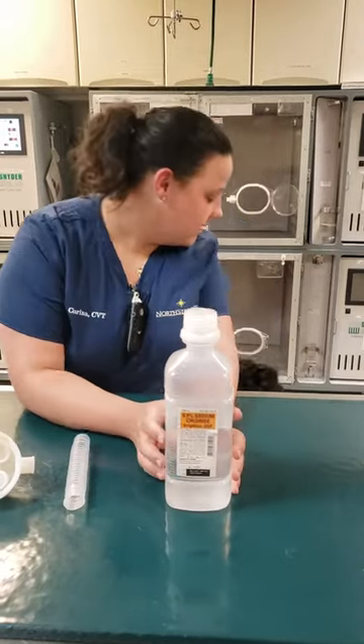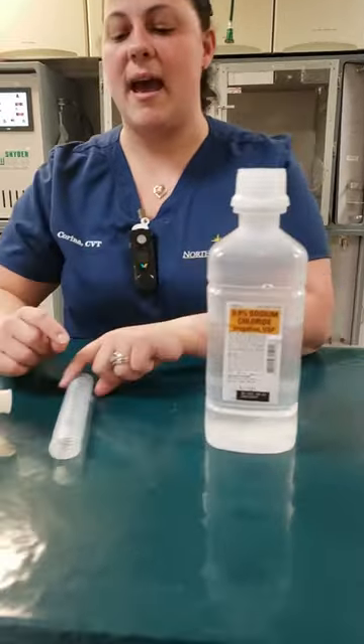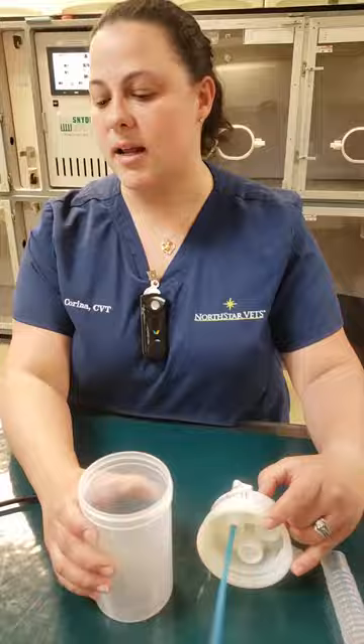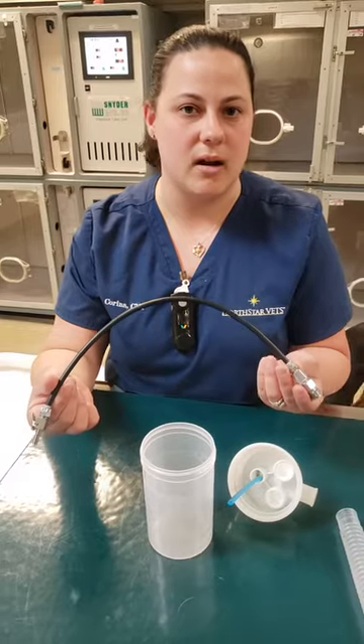This is how we're going to be doing nebulizations in ICU for the oxygen cages or in the respiratory isolation. We have our irrigation saline, we have a tube for our nebulizer unit, we have our canister and our lid, and then we have the connection from the canister to the oxygen cage. These are in the drawers in ICU or they are in isolation.